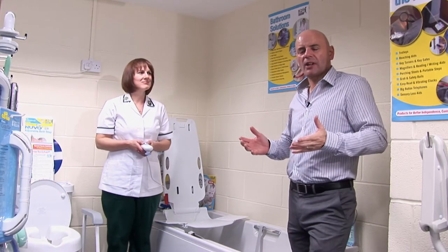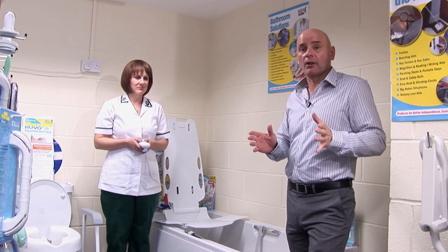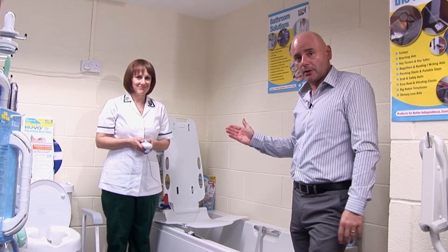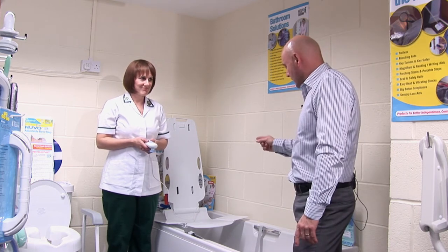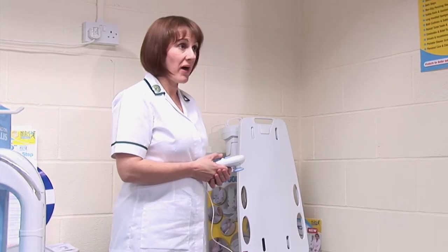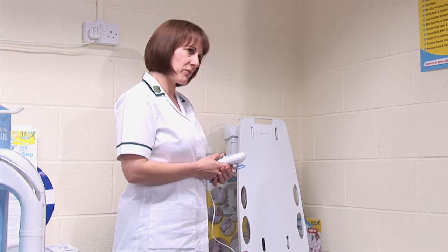For a disabled person, sometimes the simplest things in the world can be quite difficult to perform, not least when you've got to get in the bath. I'm joined by Rachel Seabrook here, who is an occupational therapist. And you've got a very interesting gadget for us here that's battery operated. This is called a Nuvo bath lift and it's designed to help lower you into the bath and get you out of the bath without any accidents.